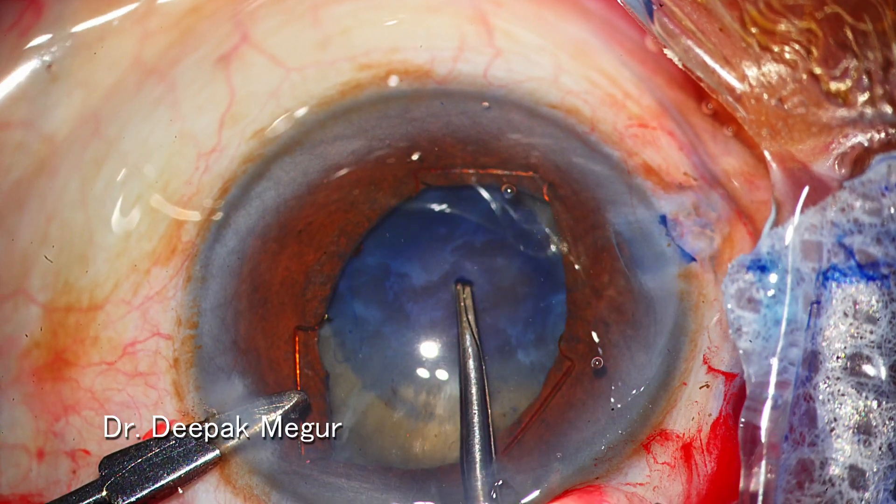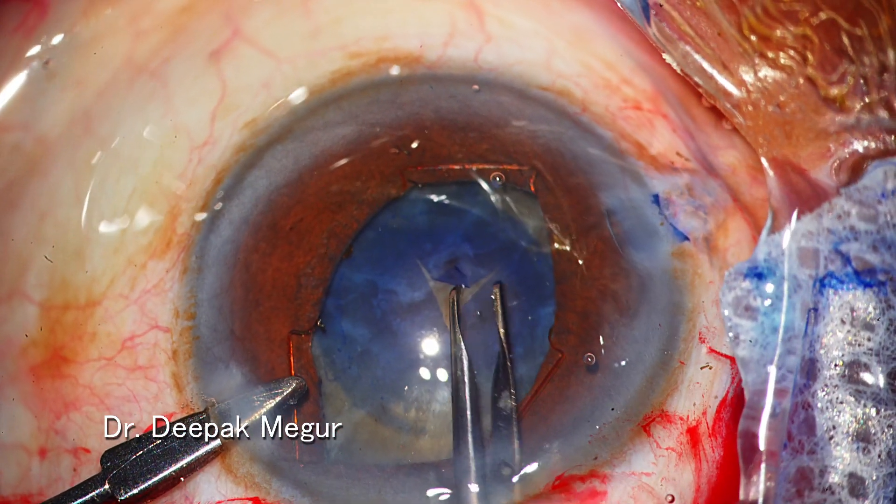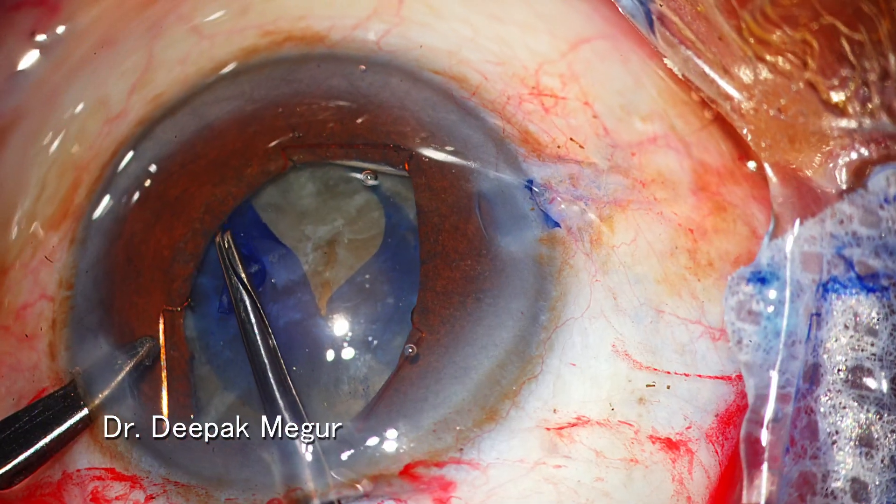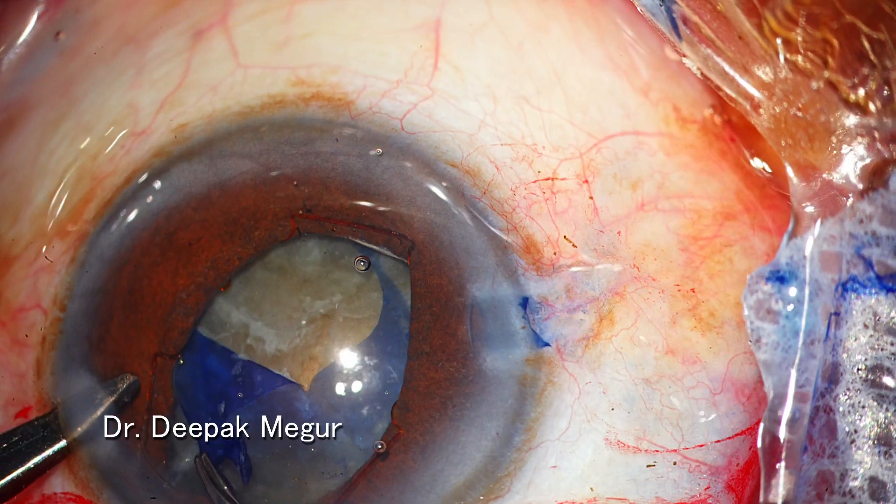The moment I puncture the capsule will let me know whether the zonules are healthy or not. The zonules in this case look all right as I can tear the capsule quite easily.